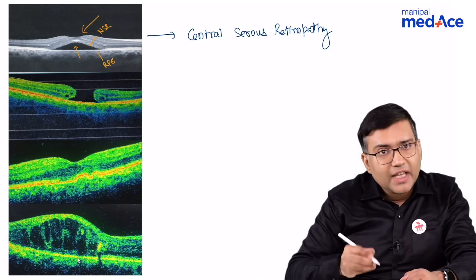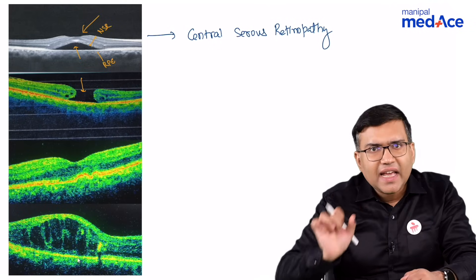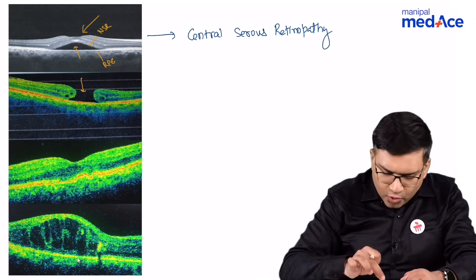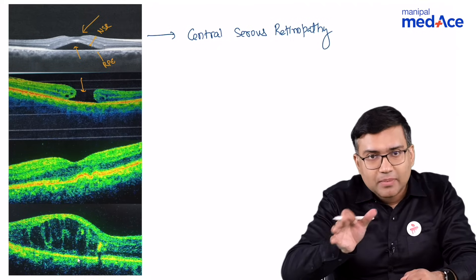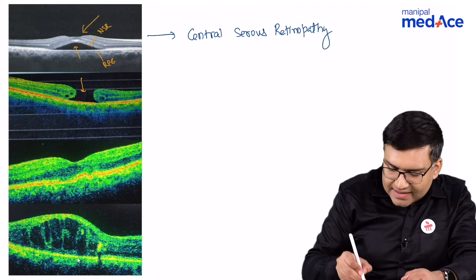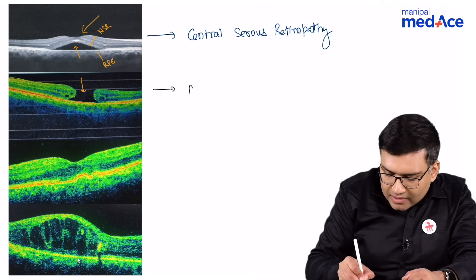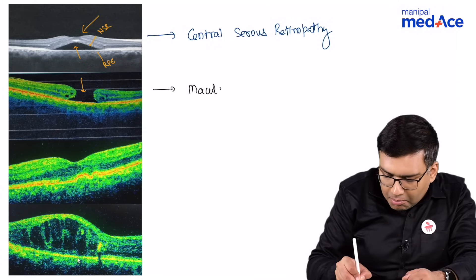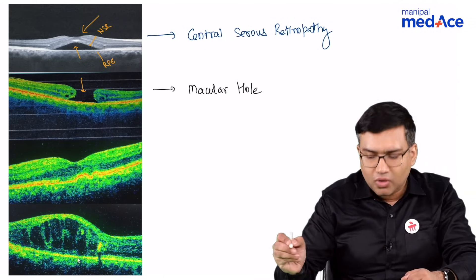See image 2. In image 2, in the area of the foveola, you can see that the layers of the retina are missing. So what is this? This is a macular hole.